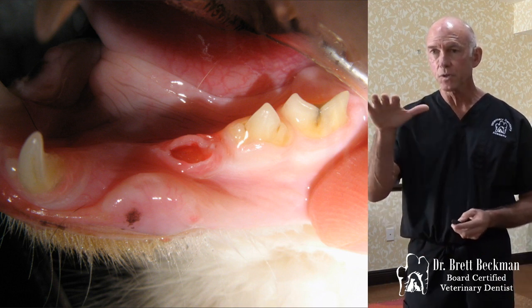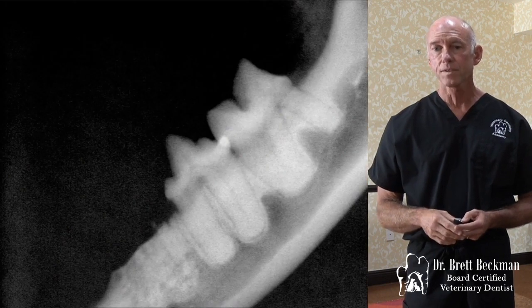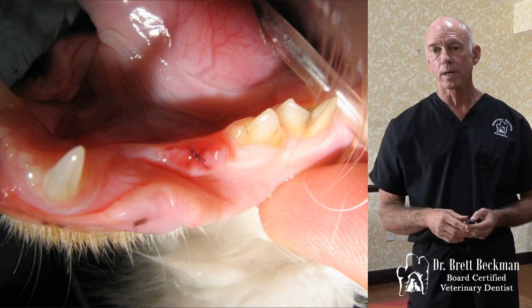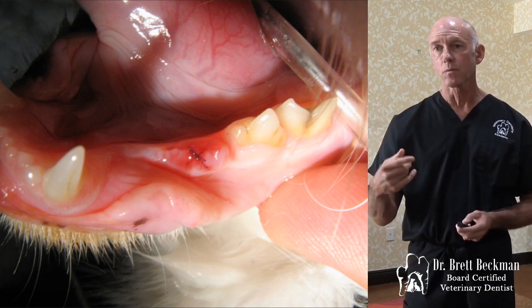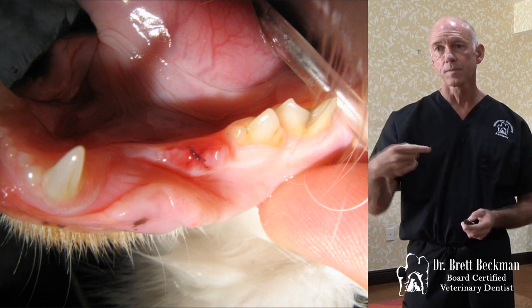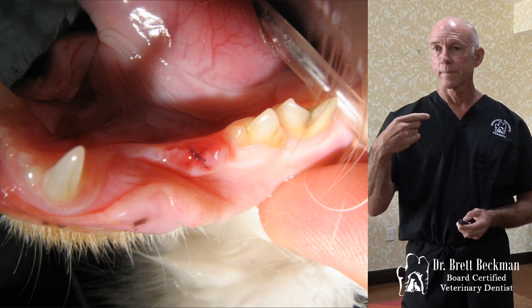Once that's nice and smooth, confirm it radiographically, and once you've confirmed that it's smooth, you can either do a couple of simple interrupted sutures, or you can do a figure of 8, where you make a pass from, let's say, lingual to vestibular, mesial.